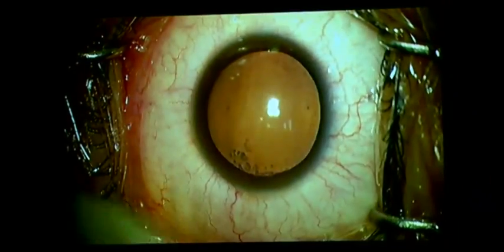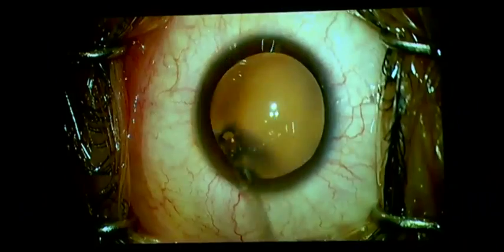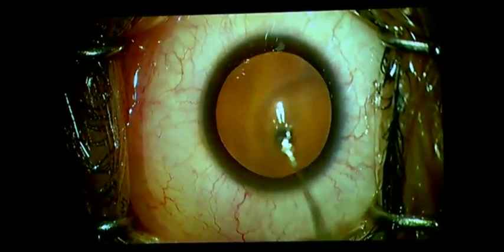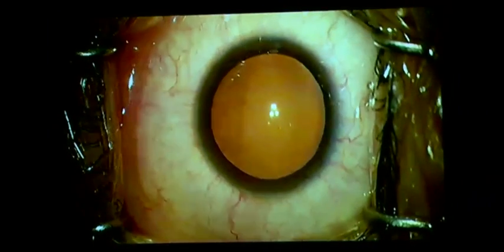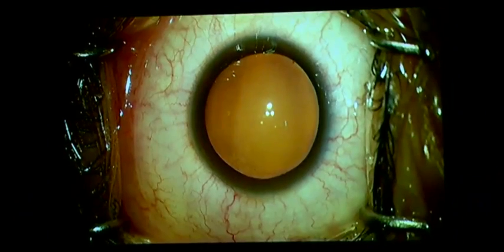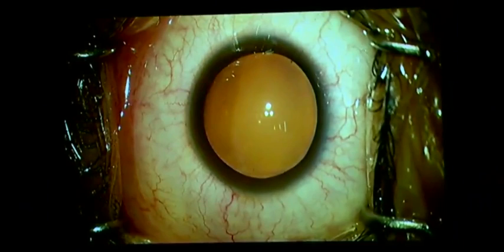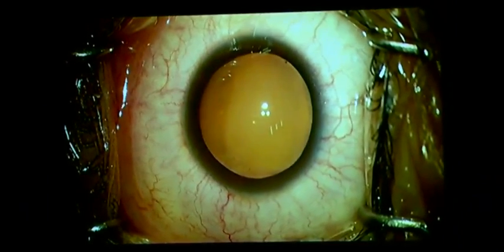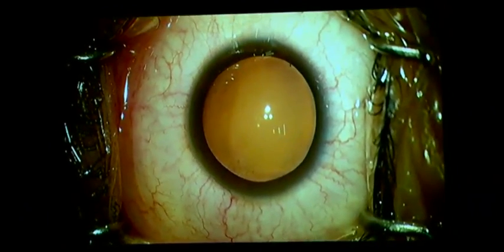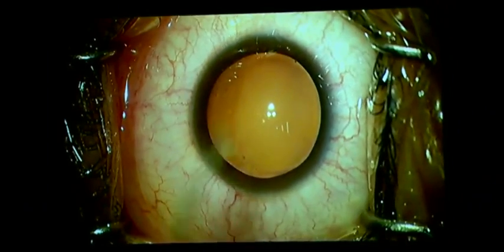Dr. Tittial, you always first load the lens and then you go to the patient. That's the way you always do? Normally, I do an incision first. Okay. Then go visco. Where is your visco, the big cannula? This is not a visco, please. The other one you had, no? Methyl cellulose, HPMC, you had a bigger syringe, no? 5cc syringe in this. Sorry. Yeah, no problem. Can you show the marker to the camera? Axis?